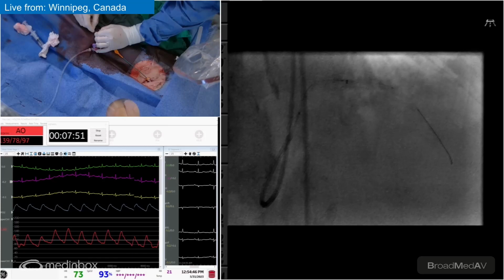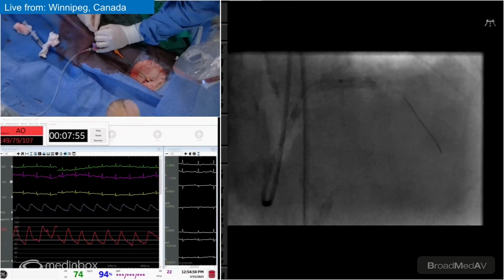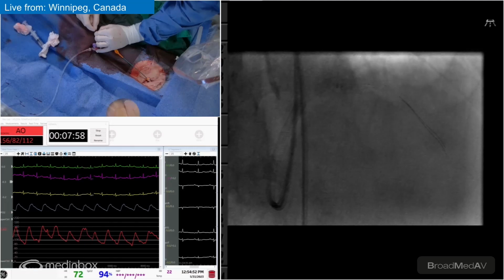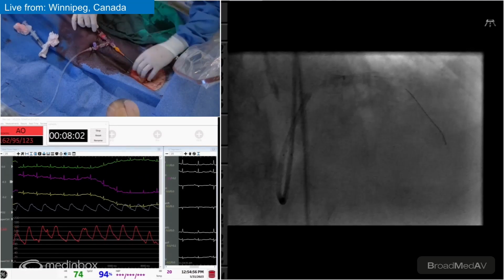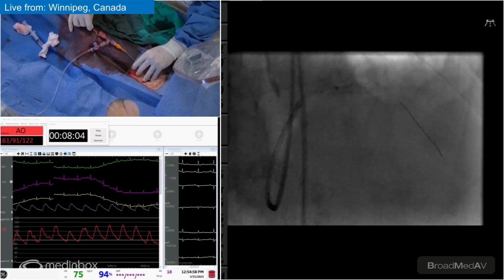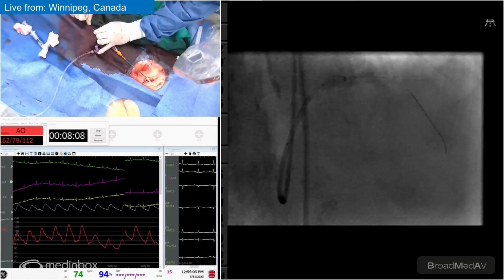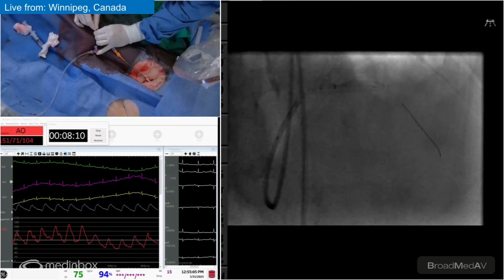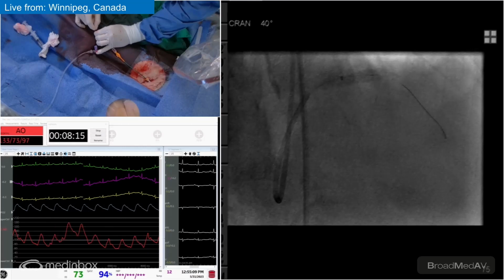Because now I think the tip of the catheter is fatigued on the OCT. Let me give it a bit more oomph there. One more time. Good old college try. Third time's the charm. My worry is we get in this. No, it's not going to go. Okay, let's get the next one, please. Please, yeah.